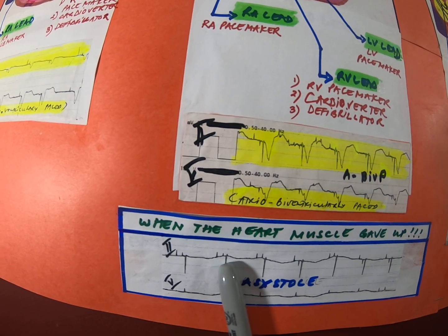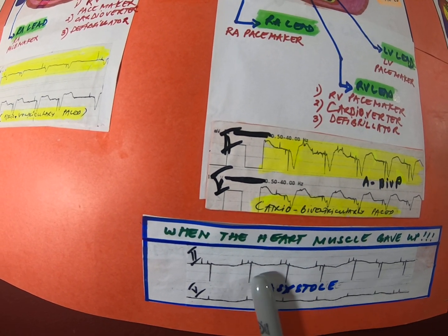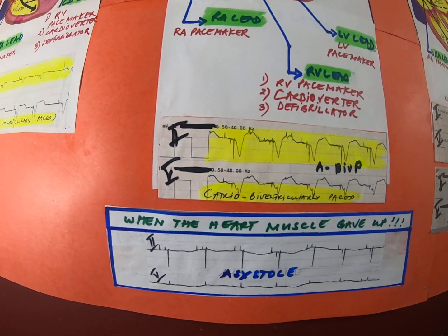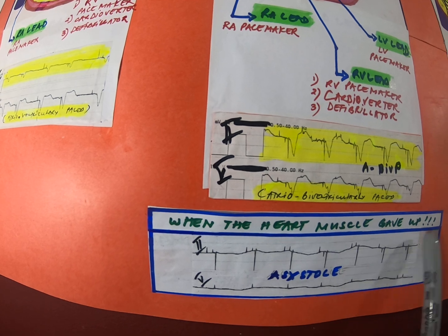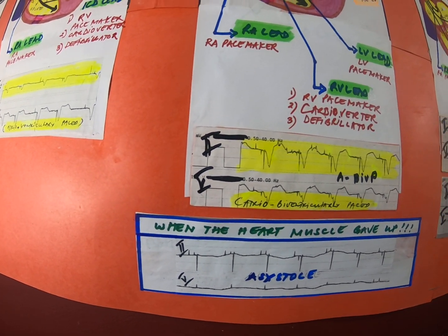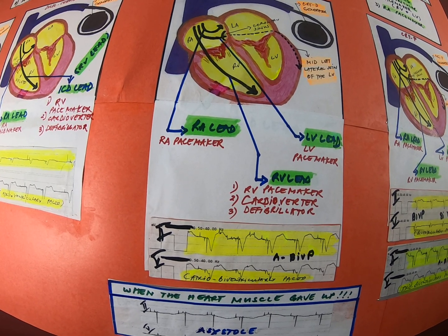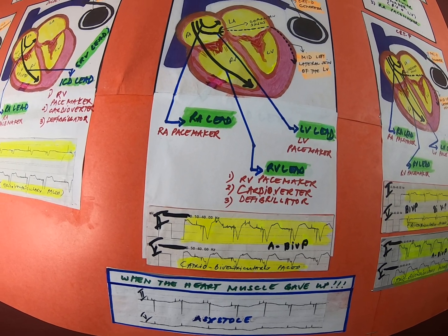So the CRT-D device is working. We have all the pacing working here: atrial pacing, biventricular pacing, they're all working here, but they are not causing depolarization and capture in the patient. So they're just spikes. They are not working. So when they're not working, you have no depolarization, you have no capture, you are actually in asystole. Usually with patients that we have, the patient, the family, and the doctor have good communication and updates, and they do what is best for the patient.